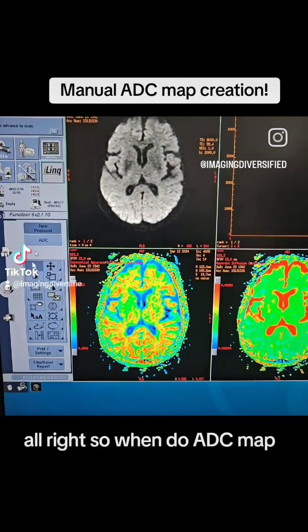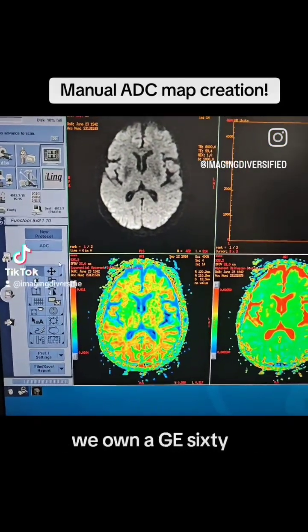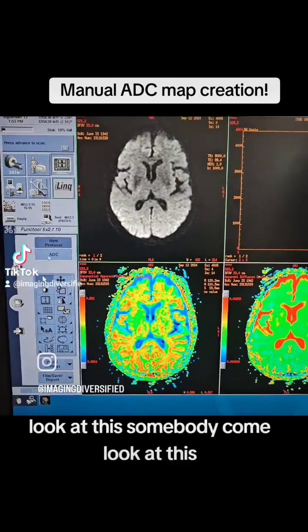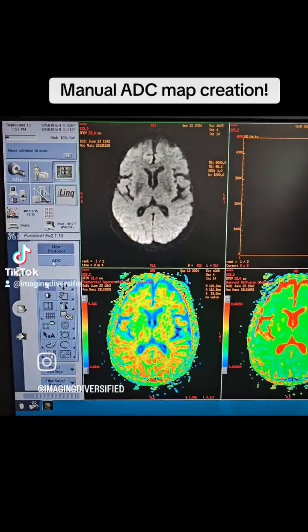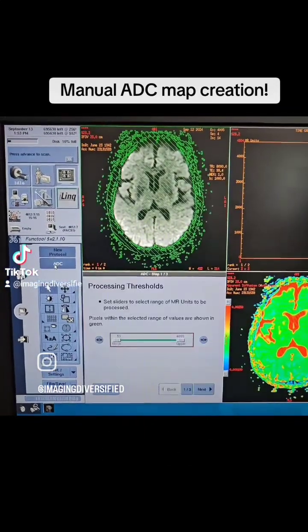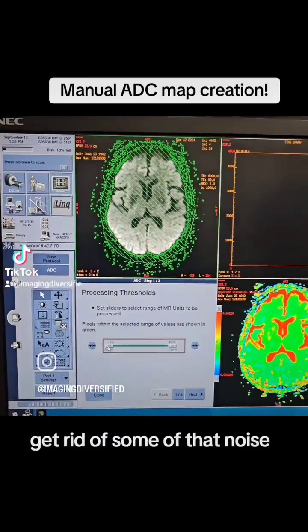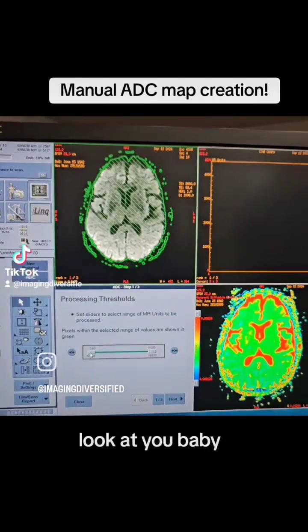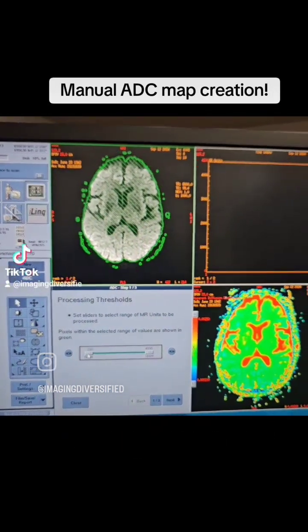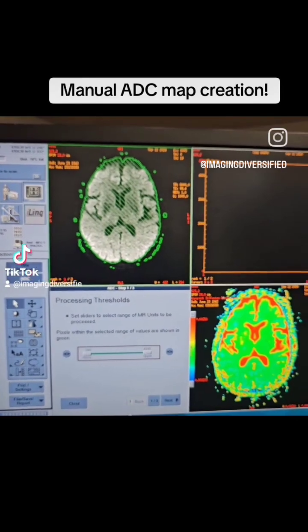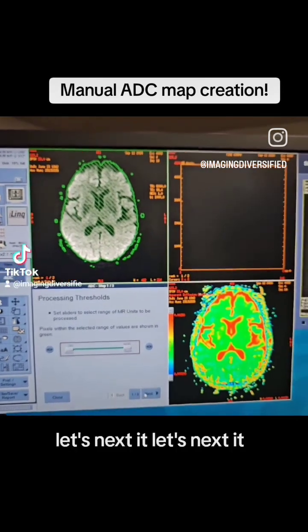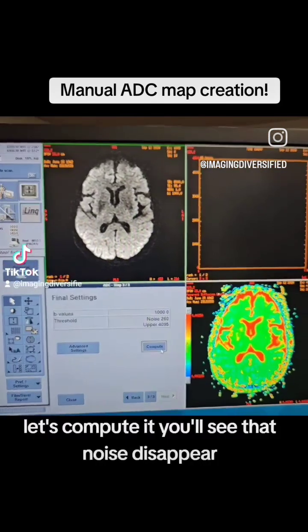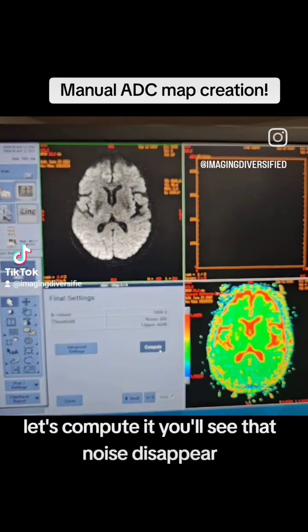All right, so we'll do an ADC map. We're on a GE16X — just like you do it, ADC. Let's get rid of some of that noise, let's next it, let's next it, let's compute it. You'll see that noise disappear.